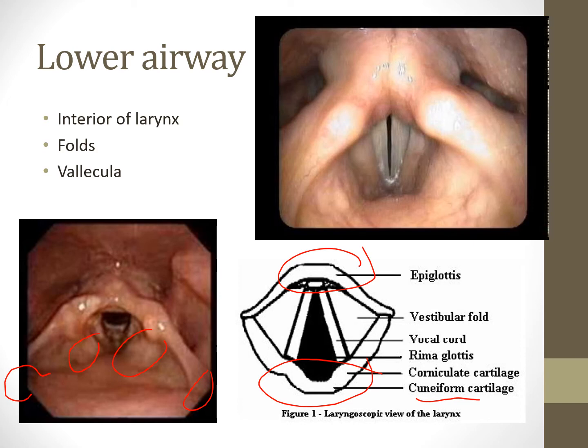One of the neat things about video intubation is the doctors are usually going to point out these structures. In our emergency department, we'd even let our pre-hospital providers, our paramedics, have the opportunity to intubate as well besides the RT, so they could see the structures, and the doctor could guide them while they're looking at it on the screen. Everyone sees it on the screen. Everyone sees the tube go through the vocal cords.